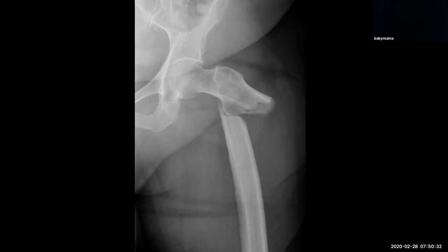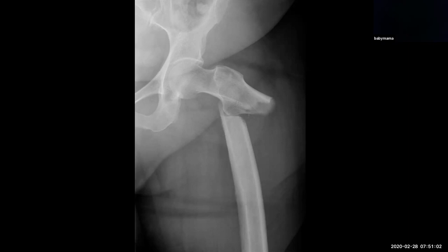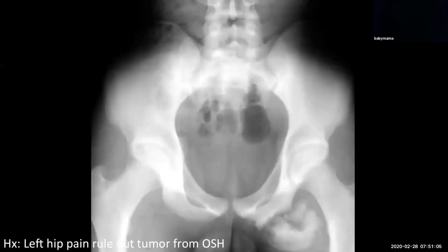Whenever dealing with a subtrochanteric fracture, take a moment and make sure you're not dealing with an underlying lesion — be it an atypical stress fracture in the case of bisphosphonates, or sometimes an underlying metastatic deposit or myeloma leading to fragile bone and predisposition to pathologic fracture. So whenever you have a subtrochanteric fracture, make sure you're not dealing with an underlying lesion the surgeon needs to know about.